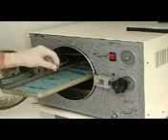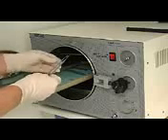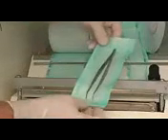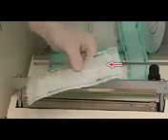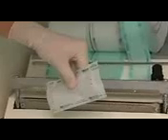This leads to an interruption in the sterility chain as soon as the instruments are removed from the autoclave and come in contact with hands and fingers. Sometimes the instruments are shrink-wrapped in a special paper foil that allows for short-term sterile storage of the instruments. However, the package cannot be damaged or the instrument immediately becomes non-sterile.